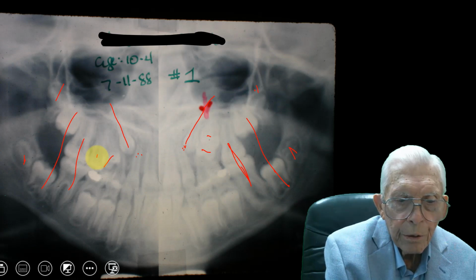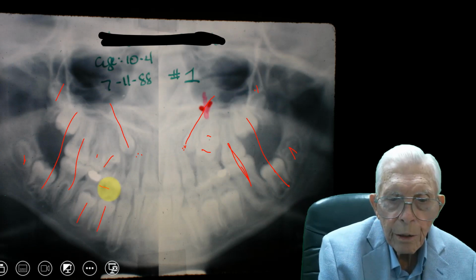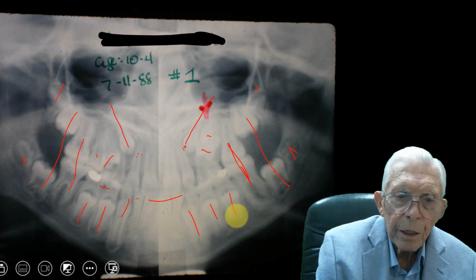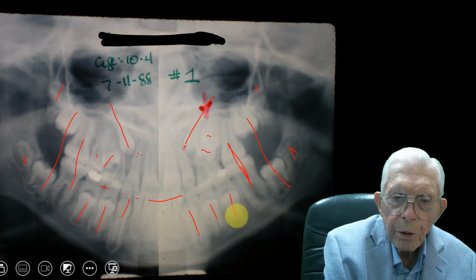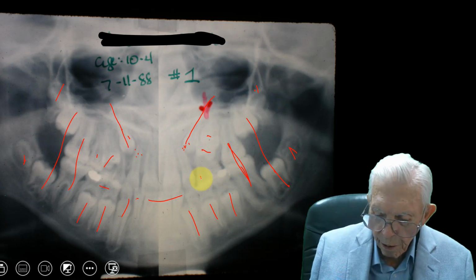Down here it's not too bad. You've got the bicuspids and then the deciduous teeth, and here are the lower anteriors and the cuspids. So let's watch what we're going to do to get this tooth turned and this one turned to go down in this area.